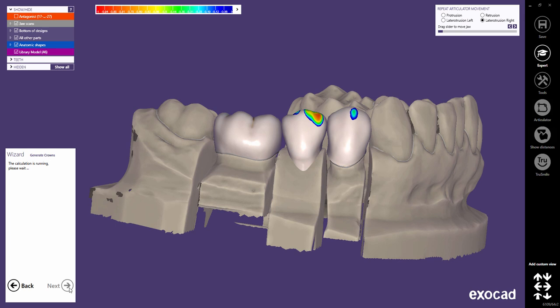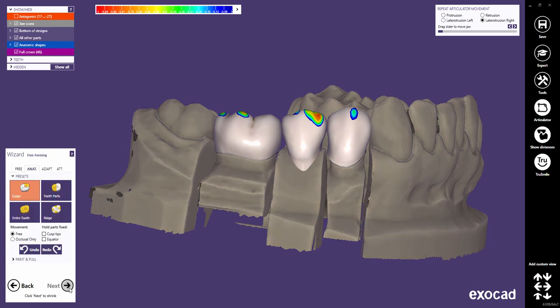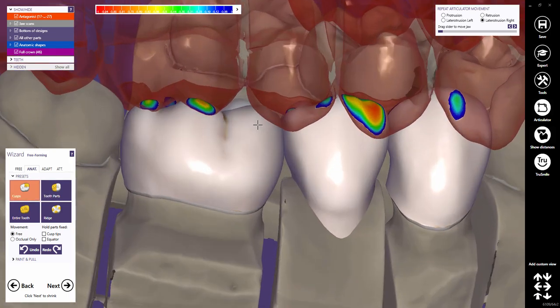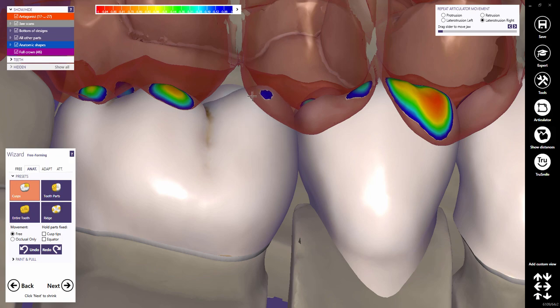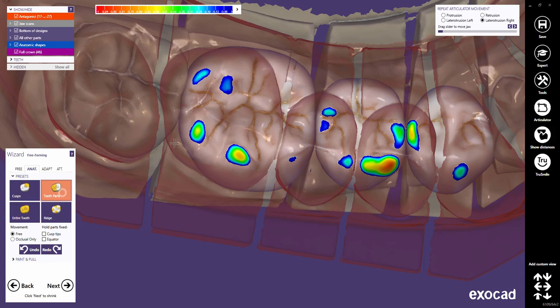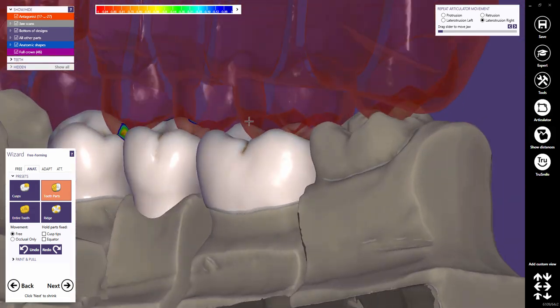The tooth models will now be adapted to the margin line. Let's have a look at the free-forming step. Now I normally activate the antagonist in the show-hide window. A semi-transparent display of the antagonist might help you to adjust the contact points more accurately. By default, the free-forming tool starts with the anatomical free-forming, which allows you to adjust the tooth shape by areas. Choose Cusps to edit individual cusps — this is a perfect tool to create or adjust the contact points. Choose Toothparts to edit the mesial, distal, buccal, and lingual side wherever you click on. This function can be used to perform bigger adjustments very quickly.